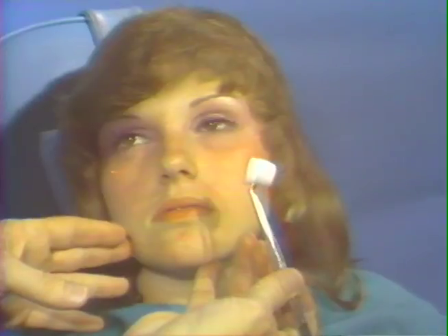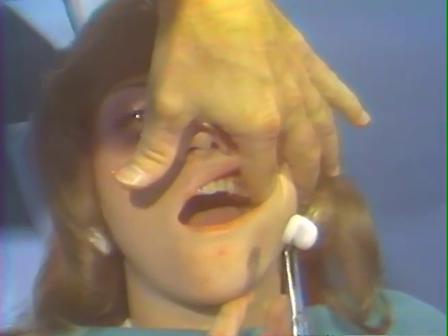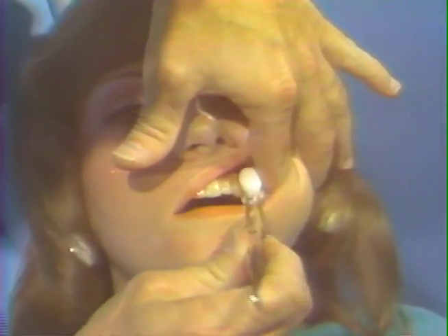Betty, will you turn your head a little bit towards me like that? I'm going to place a little topical anesthetic onto your gum here. Now open your mouth for me. Keep your head turned towards me. Don't let me turn your head to the side. Close down a little bit further. Fine, just like that. Now close your mouth. Fine, just like that.